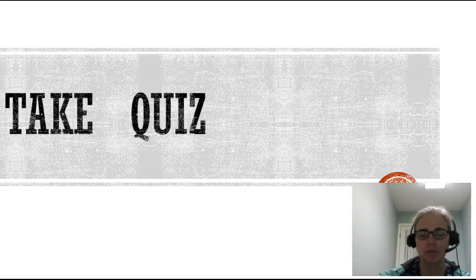Number 7, the test should be read at the 3-minute mark, and this is true. You probably will get a good result before the 3-minute mark, and you'll probably know what's going to happen, but always wait till the 3-minute mark before you give your official result.